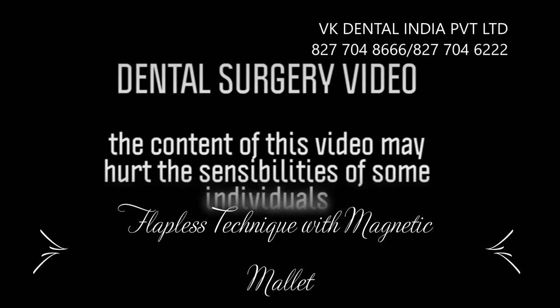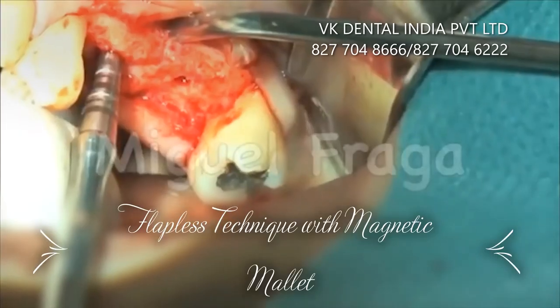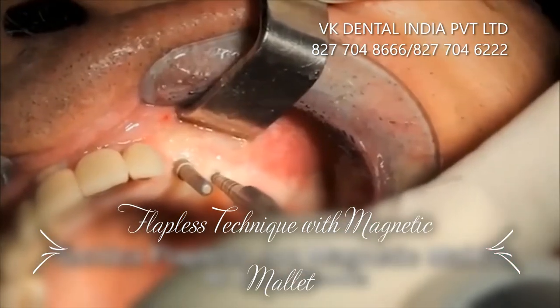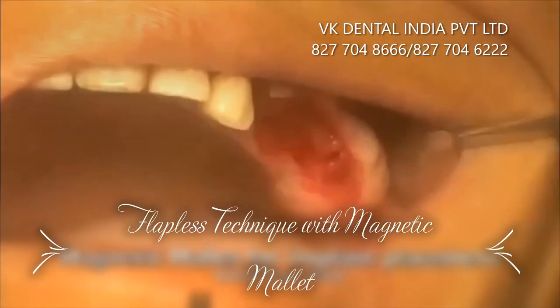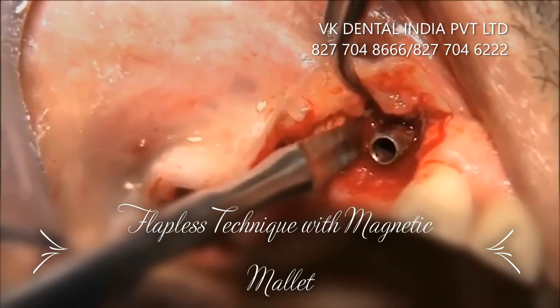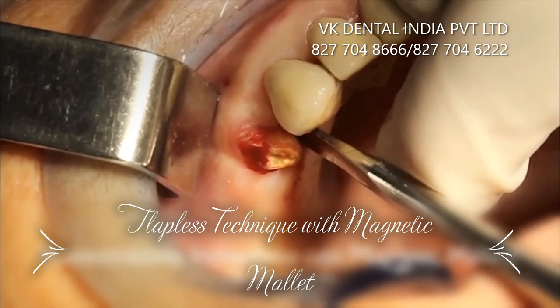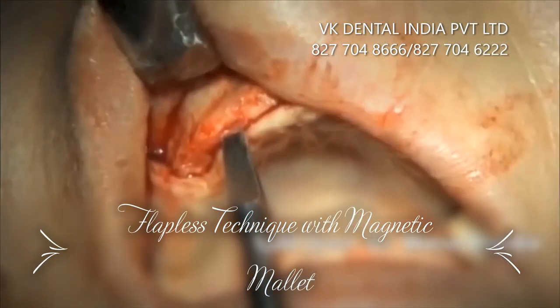Magnetic Mallet is suitable for atraumatic sinus lift, flapless implant placement, abutment extraction, root extraction, and split crest.